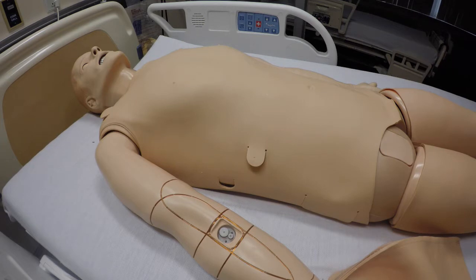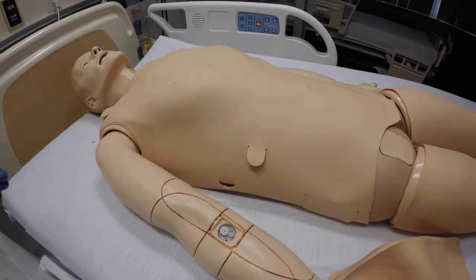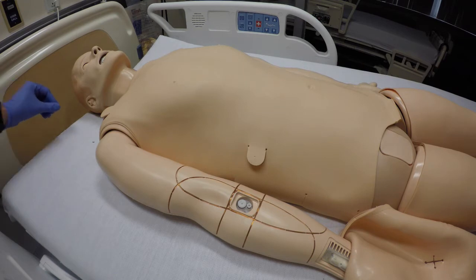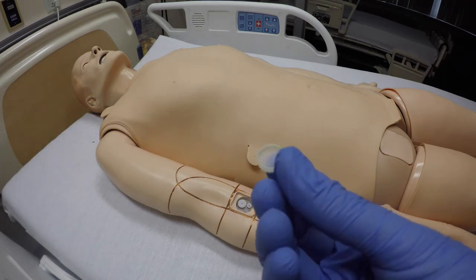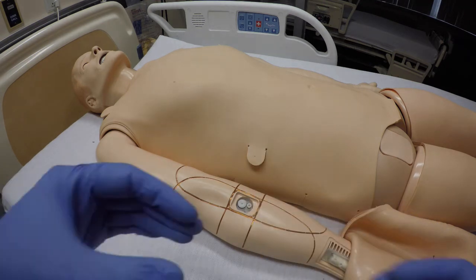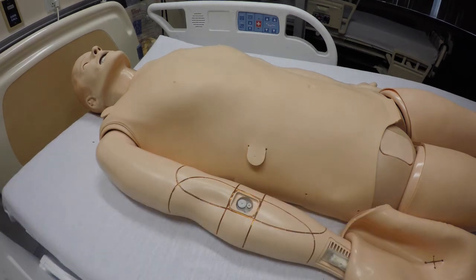Today we're going to be customizing the SimMan 3G right IV arm. What's happening is that when we're trying to push fluid through with the stock IV arm for 3G, it's not allowing fluid through or there's a lot of resistance. This is caused by a number of factors — it could be the filter that's in there, it could be clogged up, or it's the mechanism in there causing the issue.